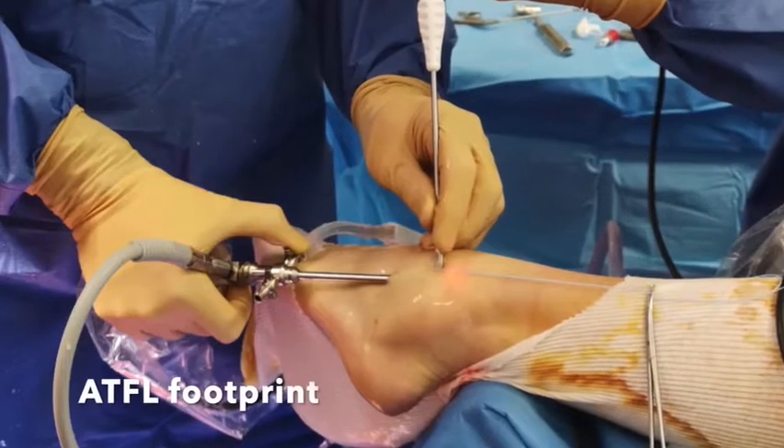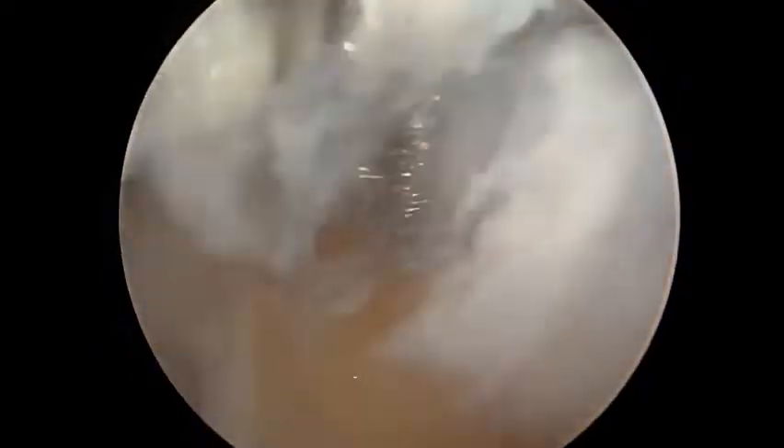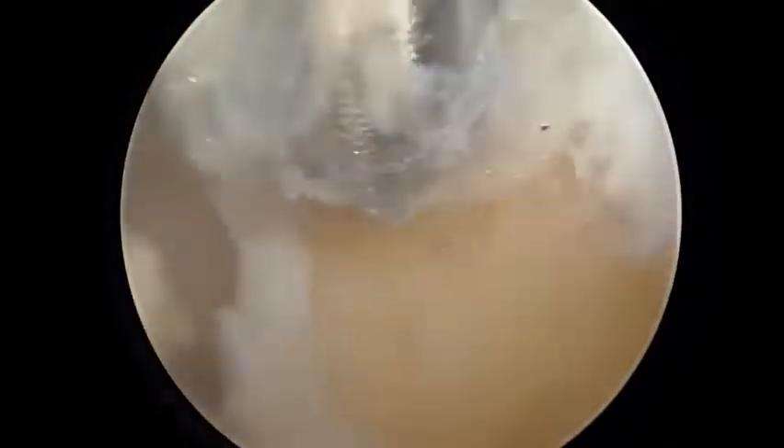The second anchor is placed in the ATFL footprint through the anterolateral portal, and sutures are passed through both the ATFL and the inferior extensor retinaculum.